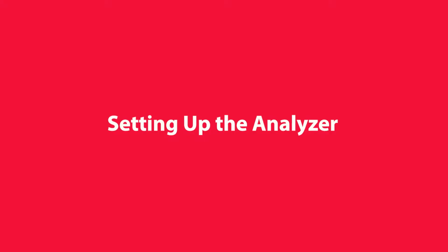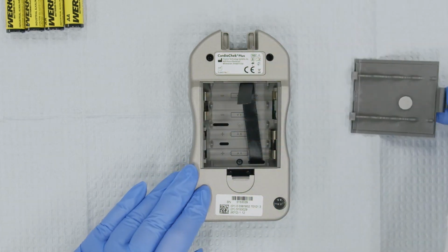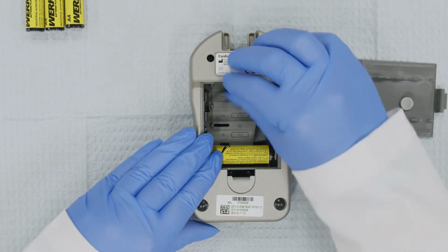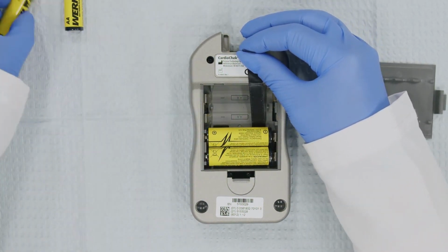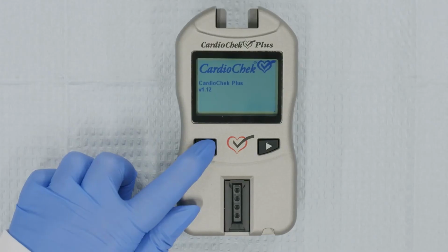The first time you use the analyzer, you'll need to install the batteries, set the language, date, and time. First, install the batteries according to the instructions in the CardioCheck version 1.12 user guide. Take a moment to make sure the batteries are inserted correctly before moving on. Now that the batteries are installed, let's set the language.